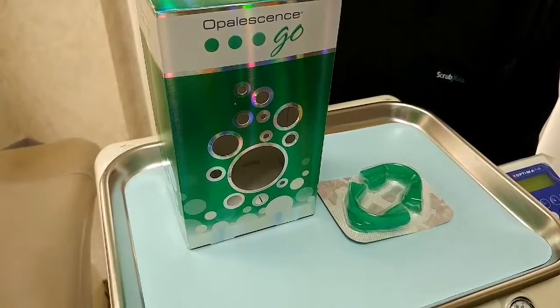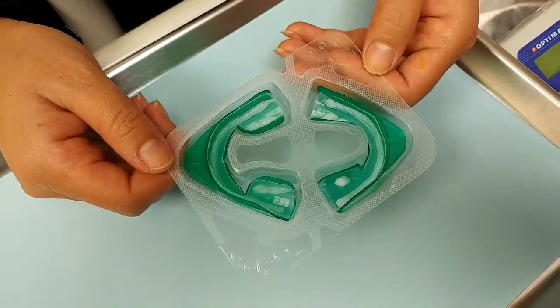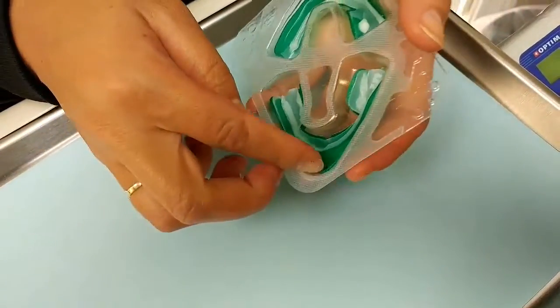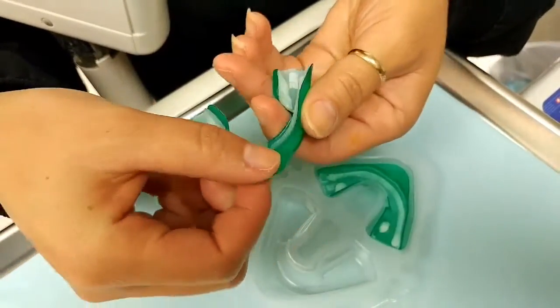When you take it out of the box, you will see one full application per package. When you open the package, you will see that there are two trays — one for the upper arch and one for the lower arch, designated by a U and an L.